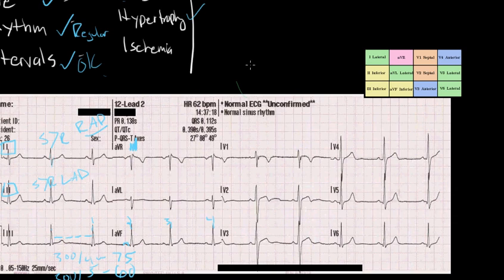Next, we look for hypertrophy. And hypertrophy can usually be found by adding up the amplitude of V5 and V6 with V1 and V2. And if that is greater than 35, that's usually a sign of left ventricular hypertrophy. And in this patient, that's not the case, which is very good.